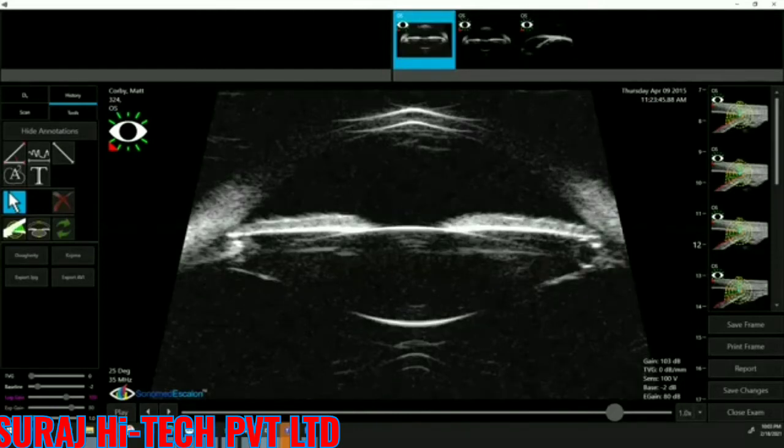Those cysts are not harmful, but they could create a lot of issues when you implant the intraocular lens into the sulcus. So that's when it becomes a case. Also, it becomes a case when you are performing an iridectomy and the ciliary body cyst is in the way and is blocking the hole after the iridectomy. So keep that in mind.